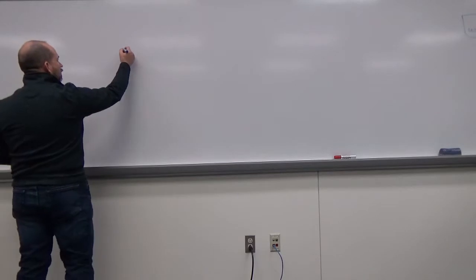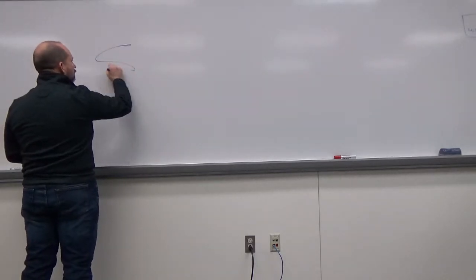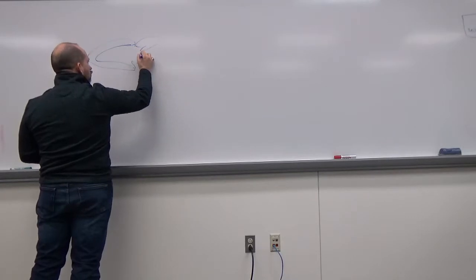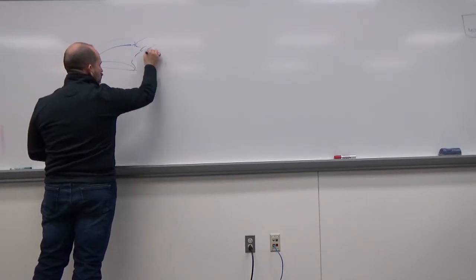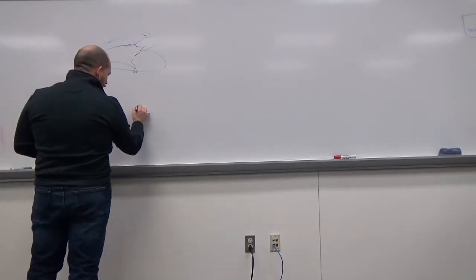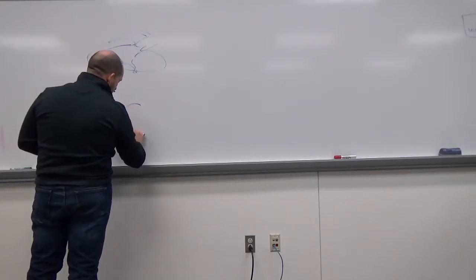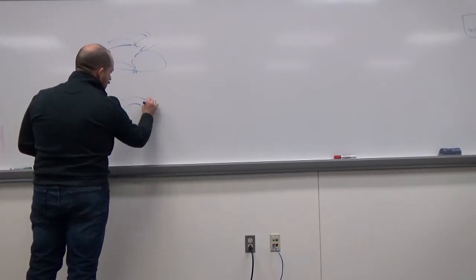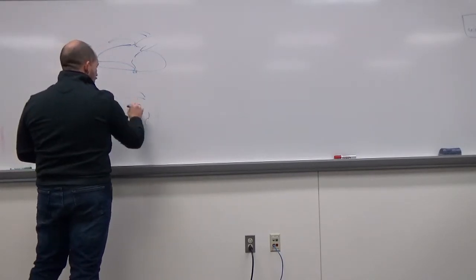So, tell me about stress echo. What's the first thing you think of? 4 views. 4 views. Okay, so what about the 4 views? Okay, next one. Short axis of the mid.